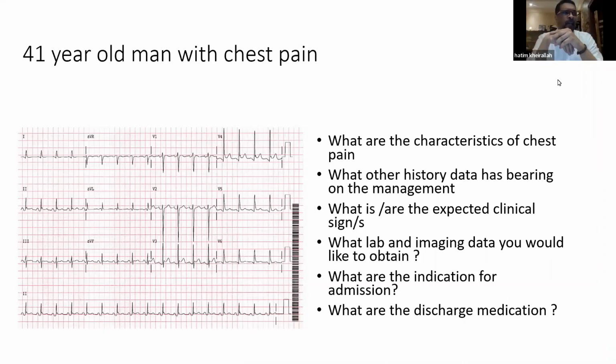Yes, you might see that, but most likely you are not going to see that. The pericardium is going to look normal in echo. You might see a trace pericardial effusion in around 60% of cases of pericarditis, but otherwise the texture of the pericardium will most likely look normal.